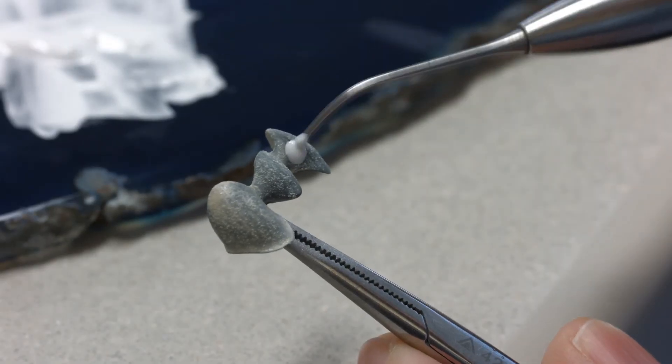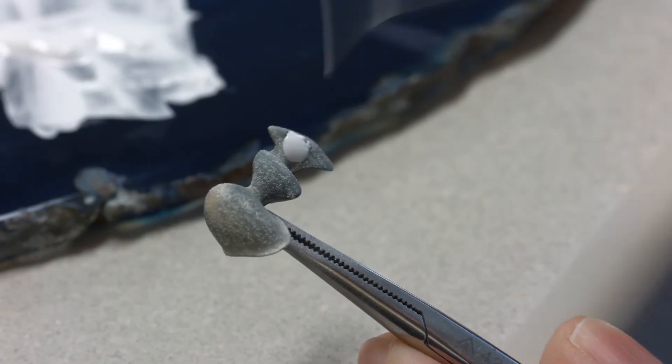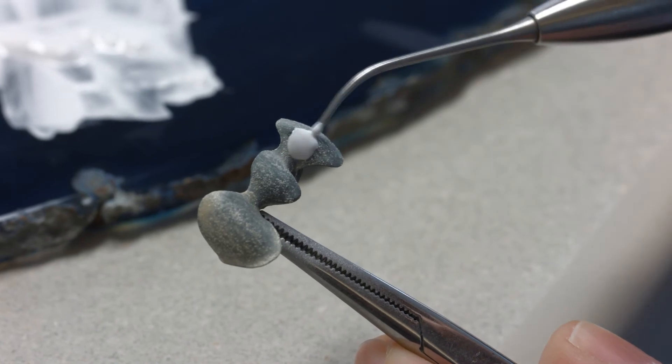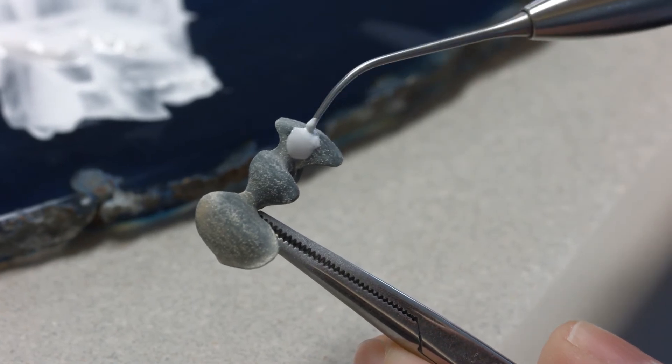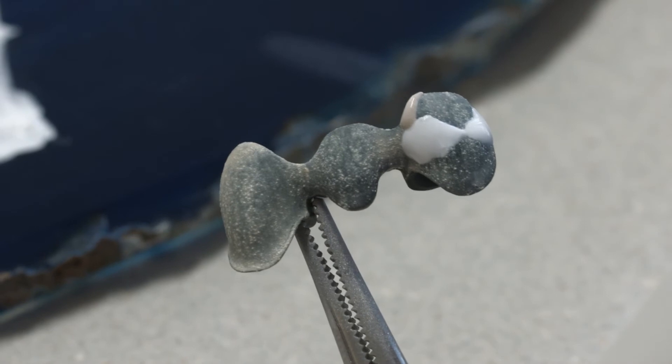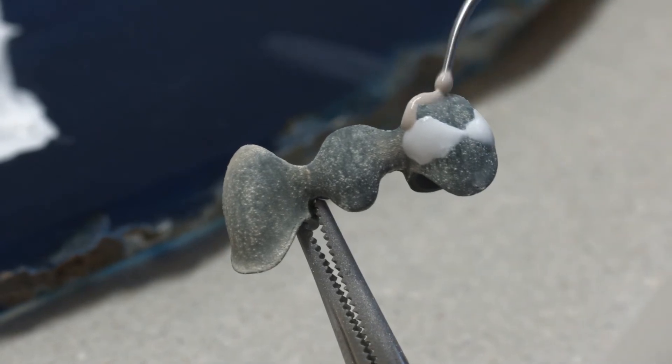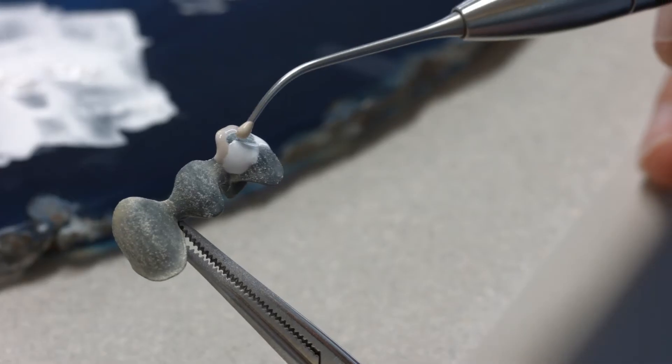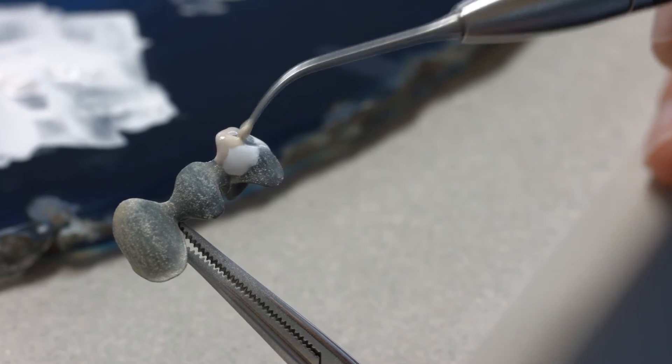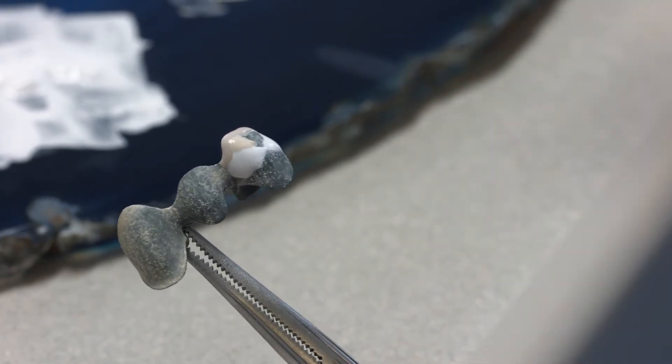Apply IPS-style Ceram Powder Opaquer in an even and uniform layer. Leave out areas in which IPS-style Ceram Intensive Powder Opaquer will be applied at a later stage, for example, cervical, incisal, occlusal and palatal areas.